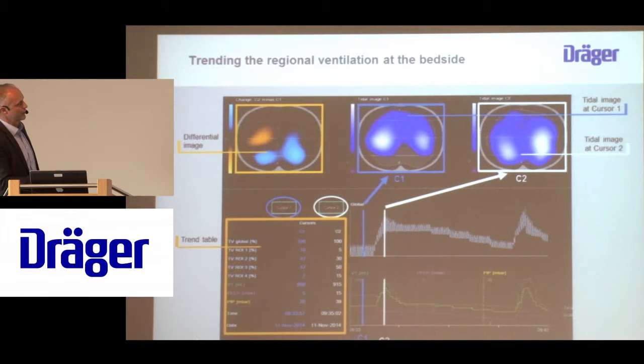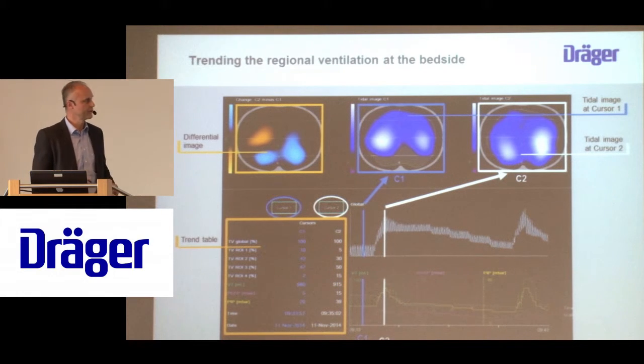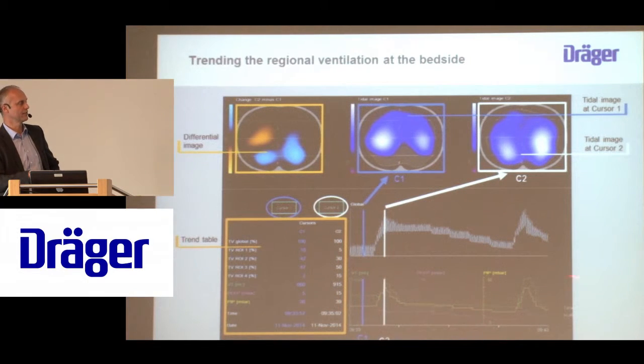Then we also have a trend table where we can compare directly the percentages for the quantification. And if we have connected an Evita ventilator, then we can also display the measured data from the ventilator.